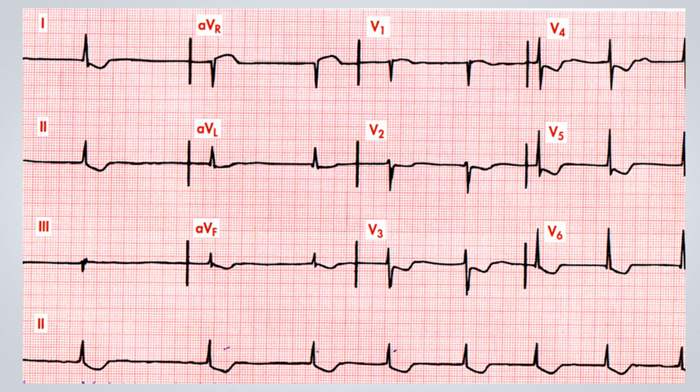Examining the electrocardiogram at hand, the striking aspect is that we are unable to discern the P wave. As we analyze the QRS complexes, we notice that despite being bradycardic — meaning we're observing a bradycardic rhythm — it remains irregular. This observation strongly supports the likelihood of atrial fibrillation.